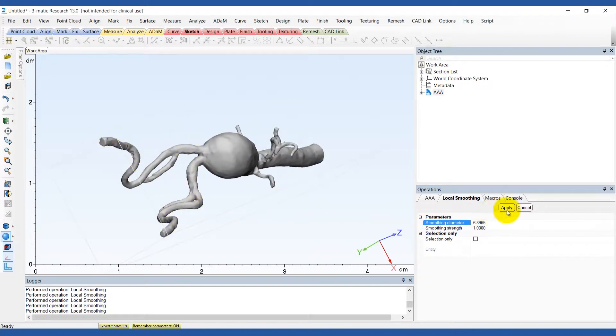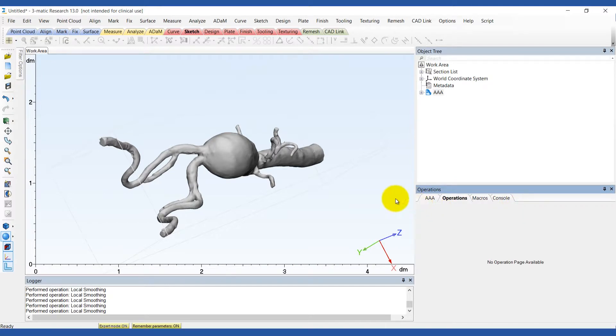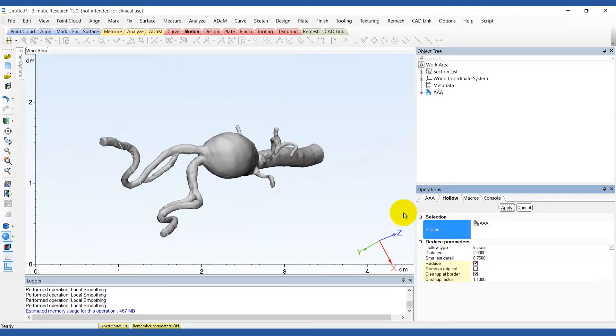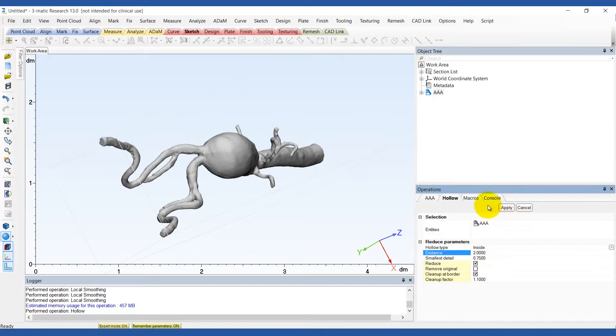Next we'll want to hollow out the model. You can find the hollow tool under the design menu. By doing this we end up creating a vessel wall of 2mm.